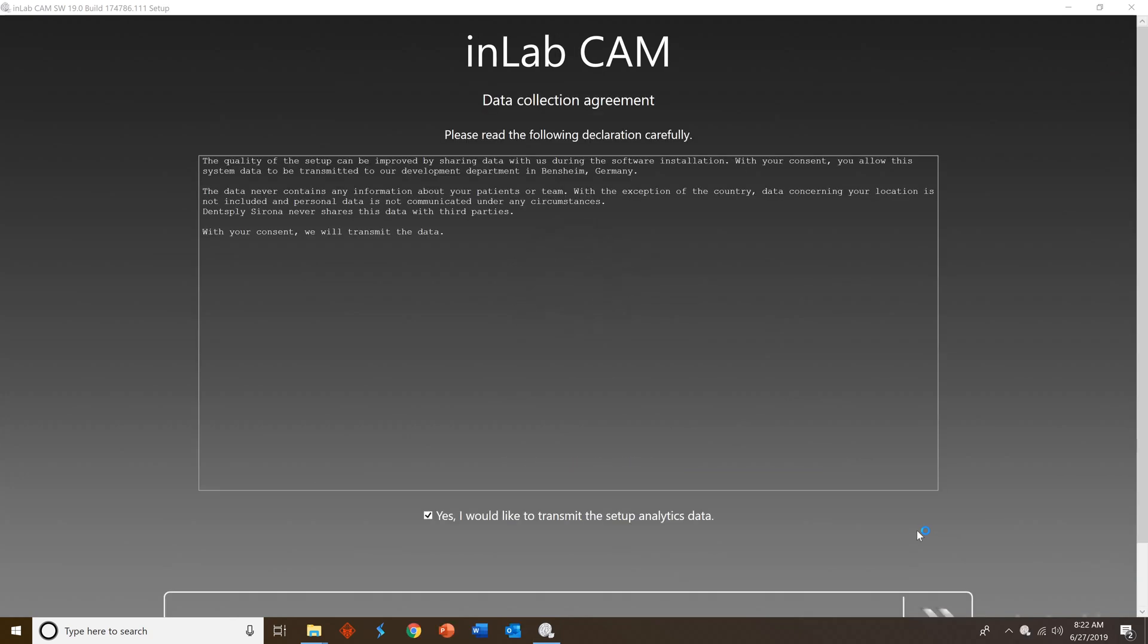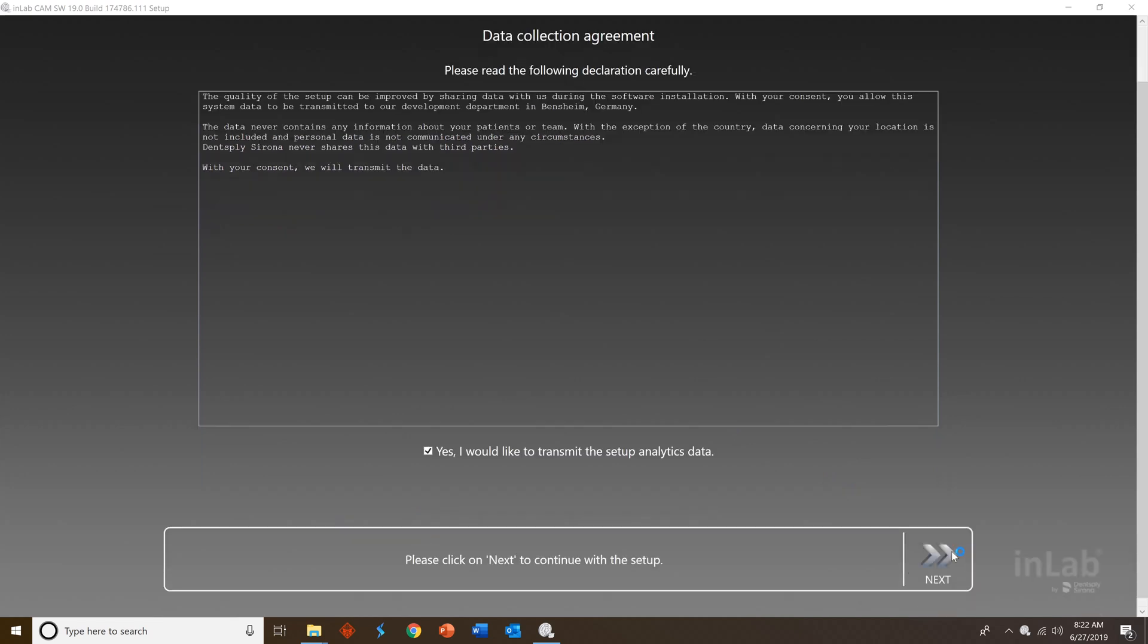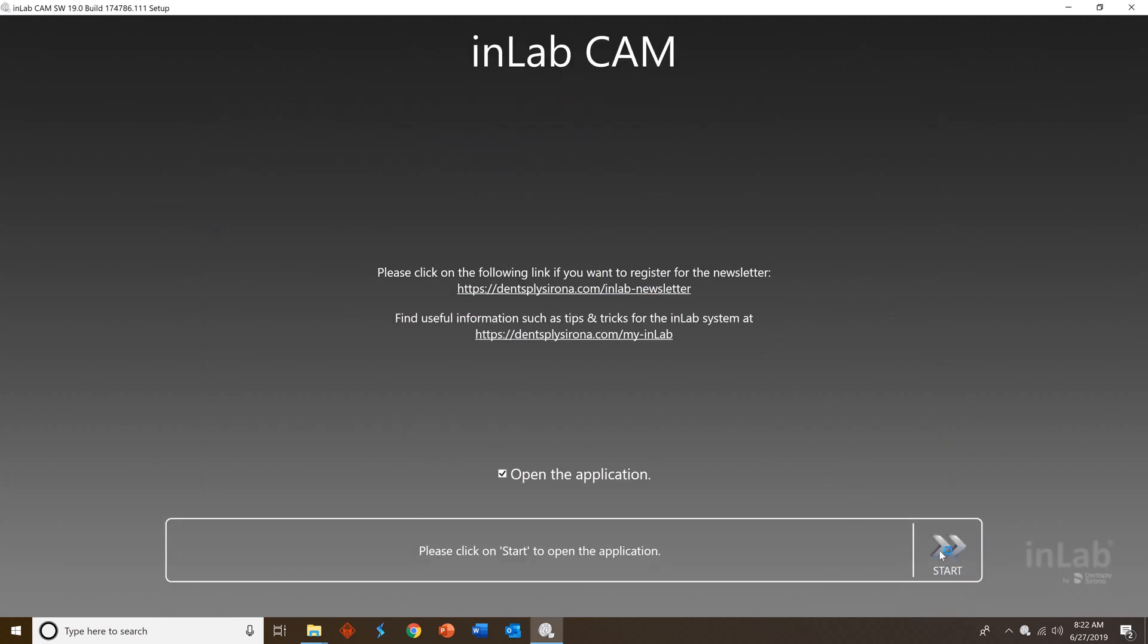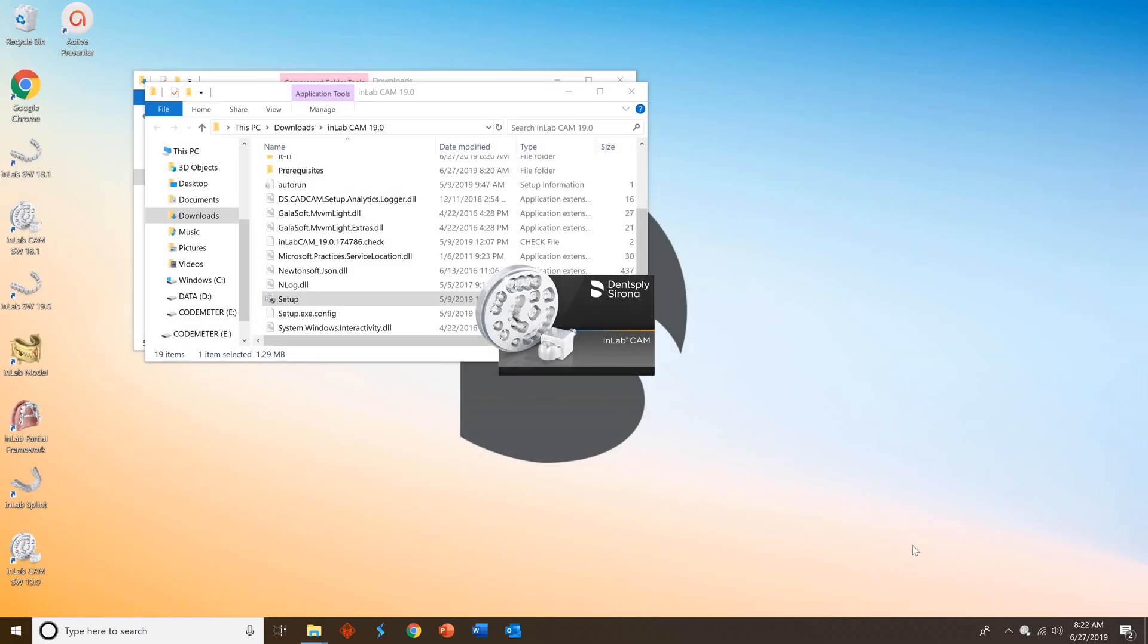Then review the data collection agreement and agree or not and press next. Then go ahead and agree to open the application and press start. This will launch the InLab CAM.